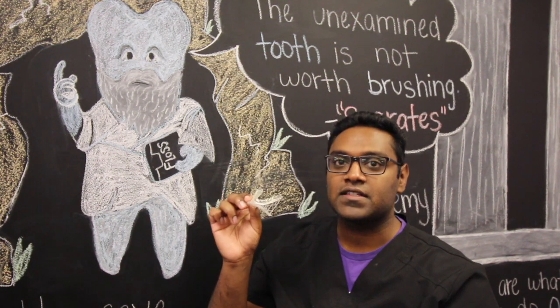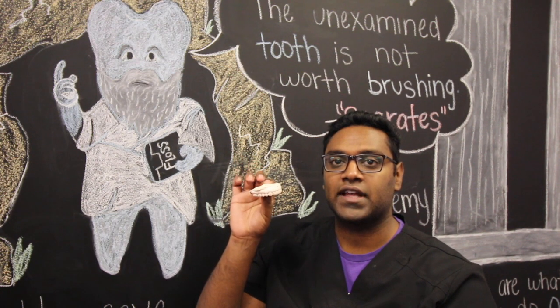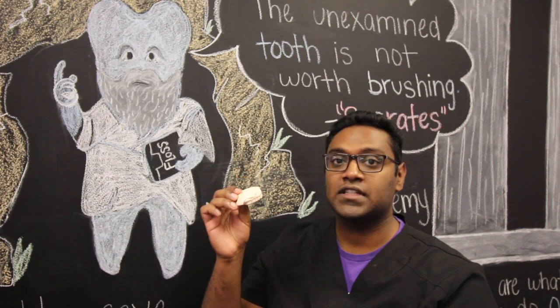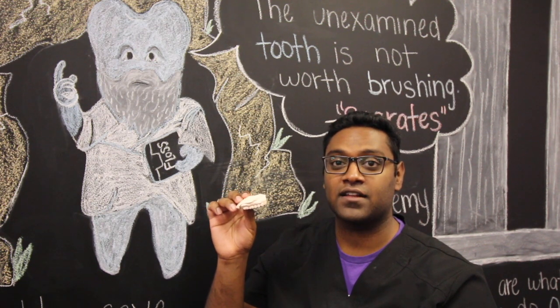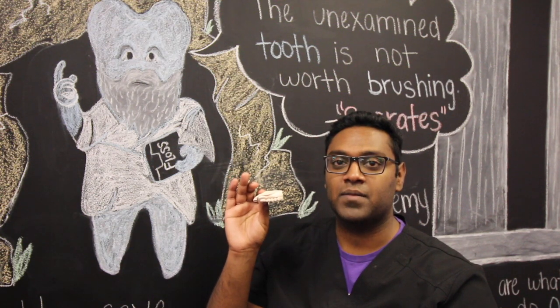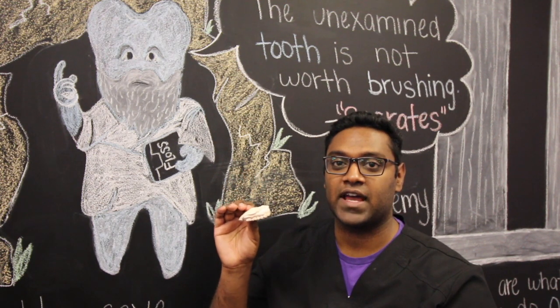We're going to design this in Mesh Mixer after we take molds of the upper and lower in alginate. You can use a leaf gauge to take an open bite in CR, but that takes a lot of chair time and is very technique sensitive. It's a lot easier just to use the upper model to design the TMJ splint and go ahead and print it and then adjust it chair side. That's going to save you a lot more time and materials.